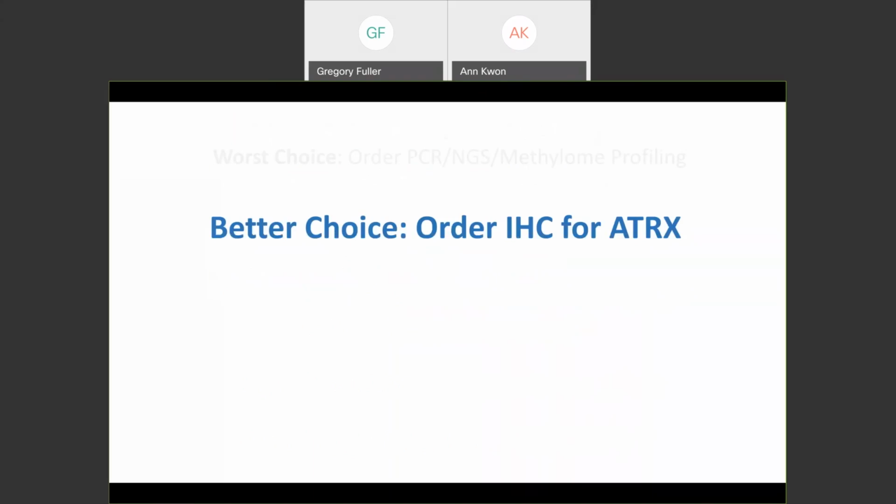How does P53 work? Here's how P53 works. Its positive predictive value is very high when it labels, let's say, 90-95% of the glioma cell nuclei in the context of a diffuse glioma, grade 2, grade 3. It is highly predictive of TP53 mutation. Its negative predictive value is extremely low, which means if the P53 is negative, that does not mean that there is not a TP53 mutation. It might be mutated, it might not.